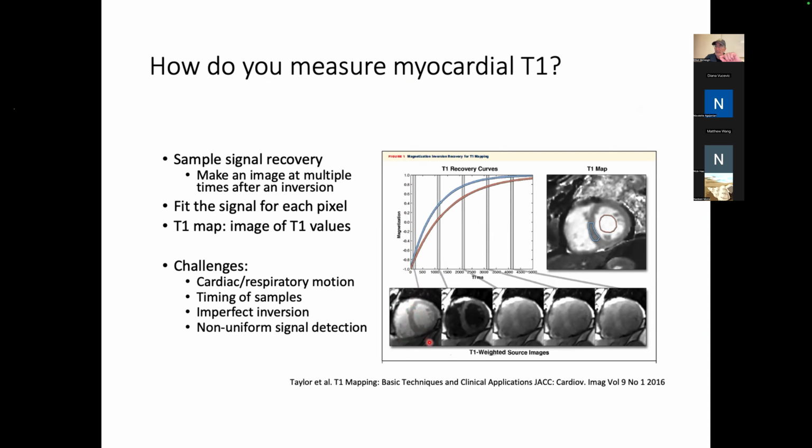We haven't reconstructed this image with the phase intact because it turns out the magnetization vectors here are in the opposite direction of these ones. They actually have a 180-degree phase shift on them. But for the most part, magnitude reconstruction is used in MRI, and so this image shows up like this.